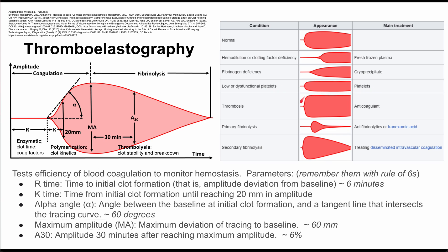If your curve looks like this, you have a thrombosis problem. You can tell that the curve is not showing any fibrinolysis — it reaches that maximal amplitude and stays there pretty steadily. So thrombosis is your problem, and your treatment is going to be anticoagulation.